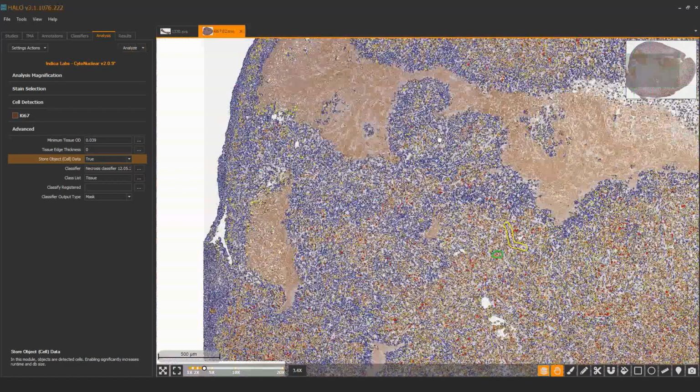So you've got a percentage of positive cells, 41%, and then the breakdown is a little bit further down here: weak, moderate, and strong. So these are the percentages. Of that 41, 22% were weak, 17% was moderate, and a small proportion, 1.9%, was strong. That's according to the threshold we set.